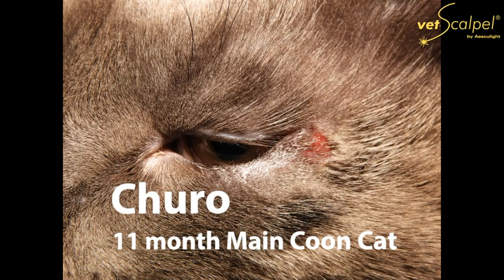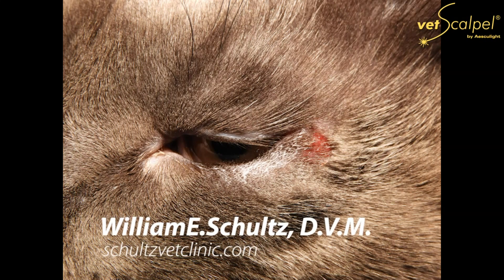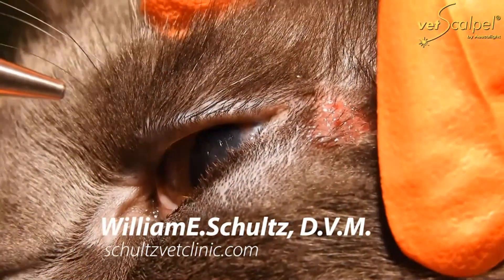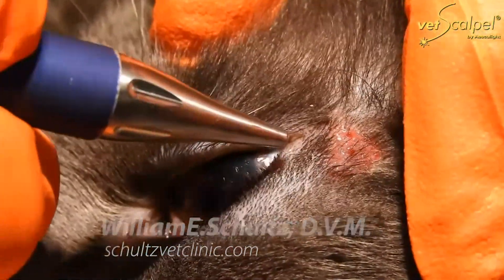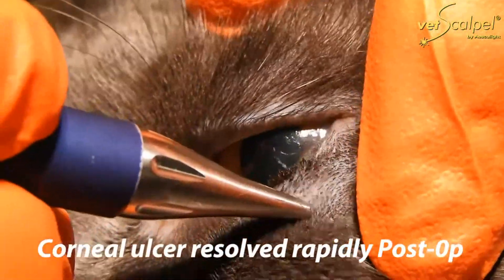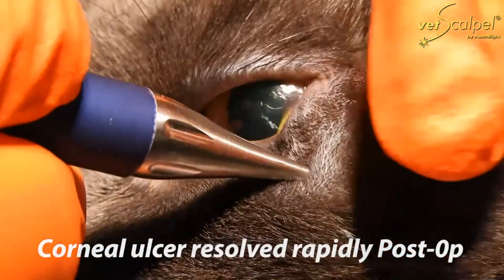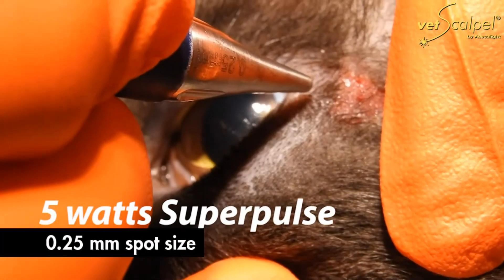Chiro is an 11-month-old Maine Coon cat. We like to let cats with Entropion get to full adult size, but his eye was getting very irritated from the Entropion, so we decided to do surgery. It had started two or three weeks before this and the lid had rolled in very quickly. He was also rubbing at his face, causing quite a bit of irritation that you can see where he was pushing on the zygomatic arch area.